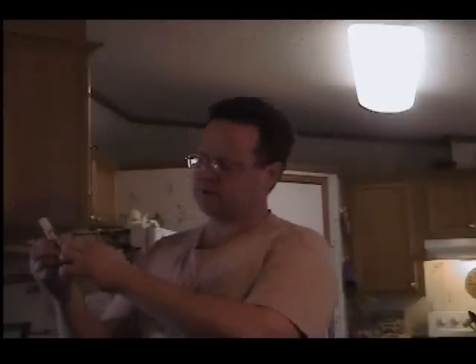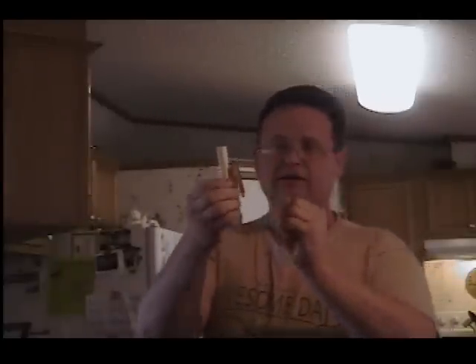Now you can see how I took the hanger and super glued it to the back side all the way down the length right here. That was to make sure that when I'm pulling on this, if for any reason it caught or torqued, I had my thumb on it, it wasn't going to break the wood out or anything like that and I'd lose it. Super glued this to here. This Ultra Gel Super Glue Loctite is excellent.